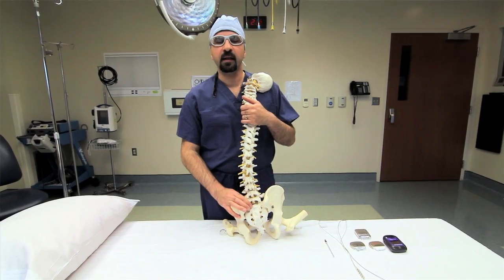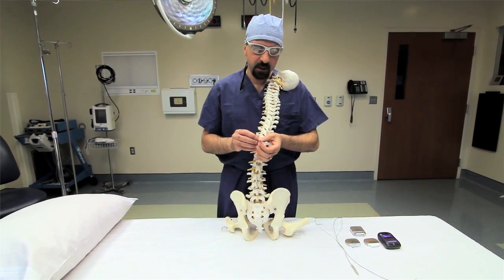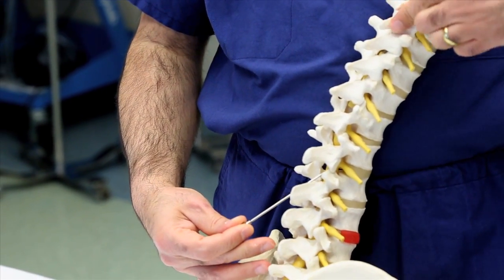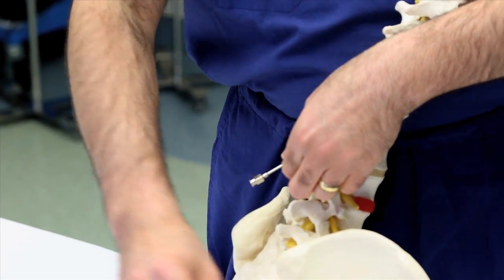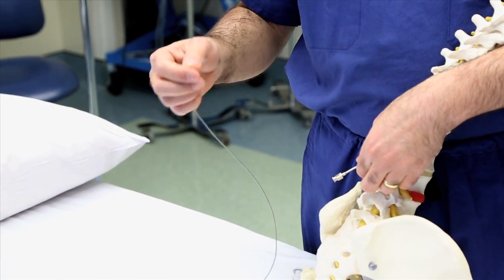The trial of spinal cord stimulator is very simple. It's basically like doing an epidural steroid injection, where we introduce an epidural needle. This is the needle. We introduce an epidural needle into the epidural space. Then through this needle, we use the spinal cord stimulator lead, and they have different leads.